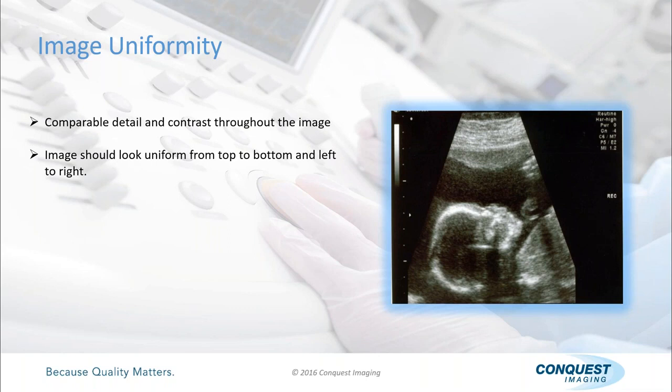So this is a pretty good 2D image, black and white, or B mode. Another name for B mode is grayscale imaging. So don't let them mess with you, because a lot of times the terminology is what catches you, right? They may say, well, I have noise in my grayscale. And you're like, oh my God, what's that? It's just 2D imaging. That's all they're talking about. 2D, B mode, and grayscale all mean the same thing.